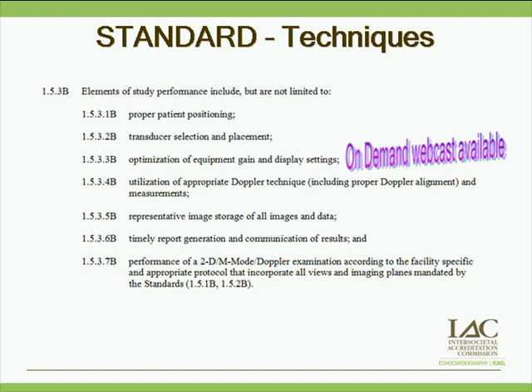Utilization of appropriate Doppler technique, including proper Doppler alignment and measurement. Again, it's back to the basics. Representative image storage of all images and data.